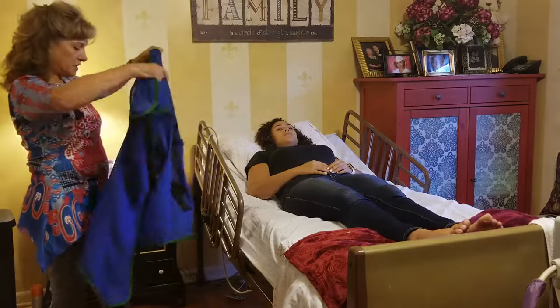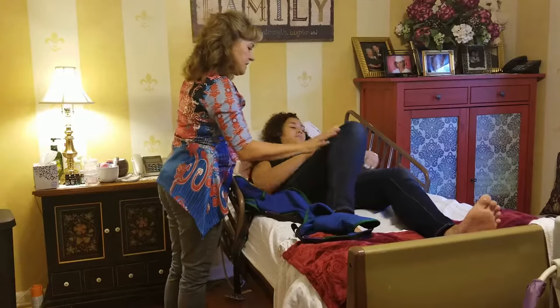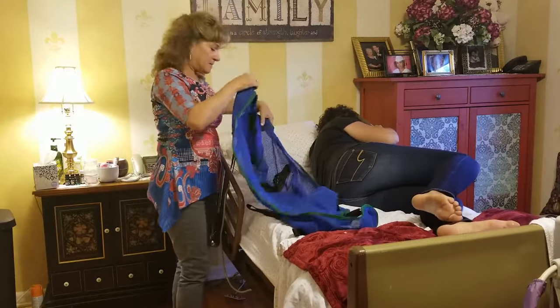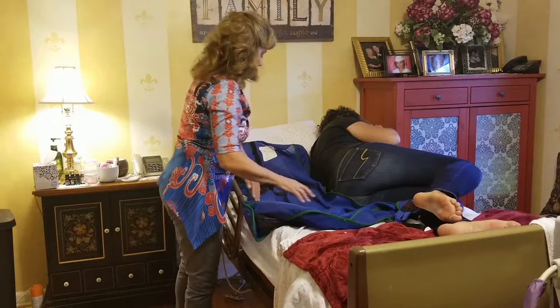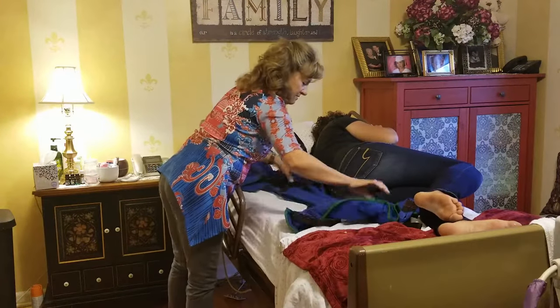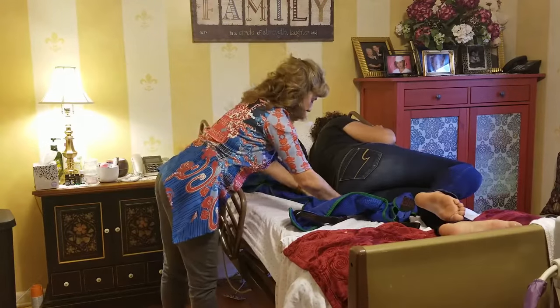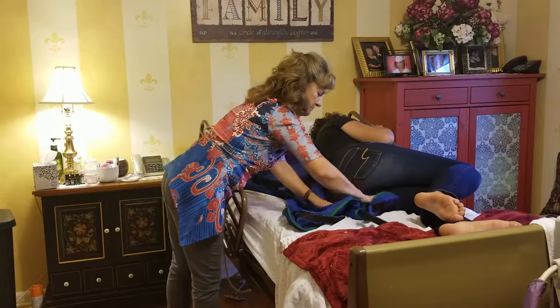Tell the patient what you're doing — have them roll to the side and bend their knee if they can, and hold on to the railing. Talk to them every step of the way; some people are afraid of these lifts, but once they're on they find it's not so bad — kind of like being on a swing chair for a few minutes. Take the sling like you would a draw sheet, gently curl and roll it under the patient, centering it so there's support under the neck area and the lower body.